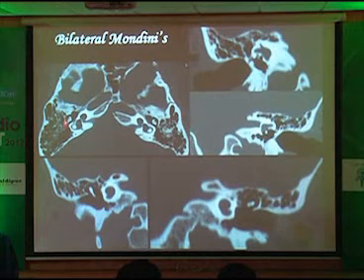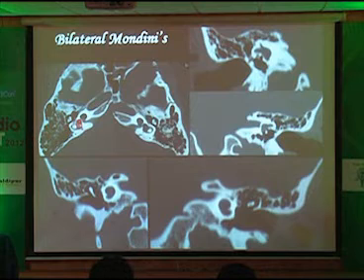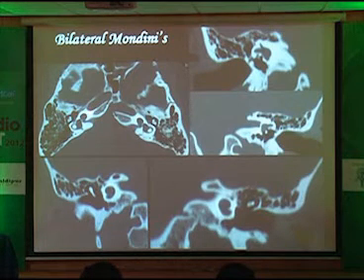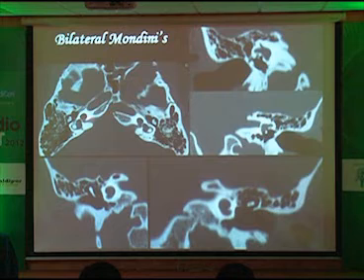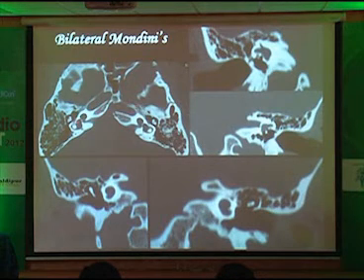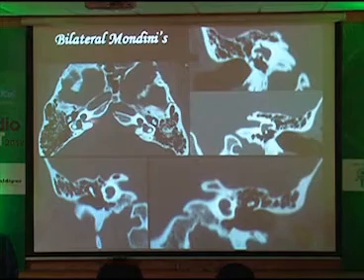Bilateral Mondini: dilatation of the vestibule and loss of normal architecture of the cochlea — beautifully seen on both sides. Ice cream cone normal, ossicles normal, IAMs normal.